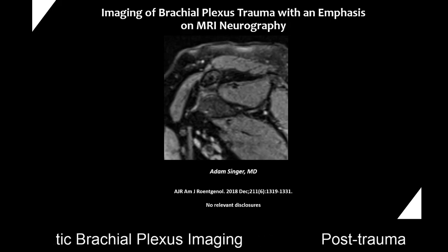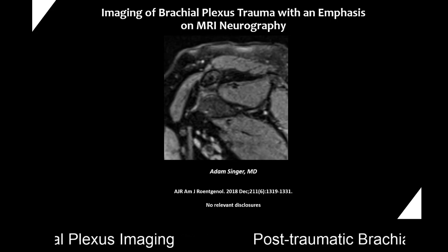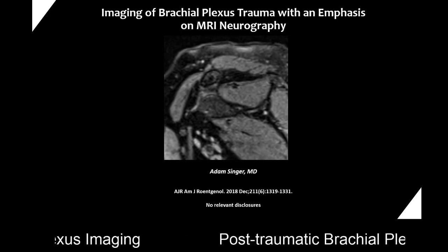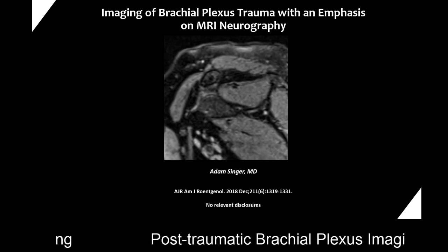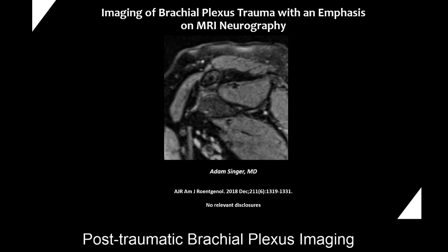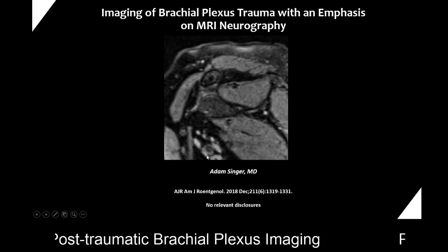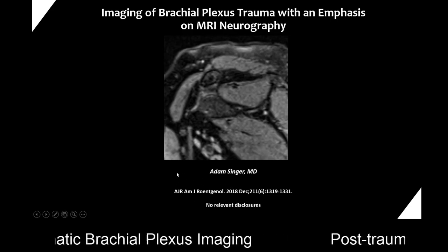I'm from Atlanta, Georgia, and today I'm going to be discussing imaging of the brachial plexus following trauma, and I'll be emphasizing MRI and MRI neurography, though I will touch on a couple of other imaging modalities. If you'd like to see more information about this topic, feel free to look up this paper where we review this in a little bit more detail.